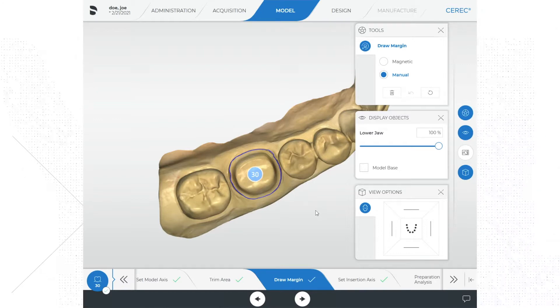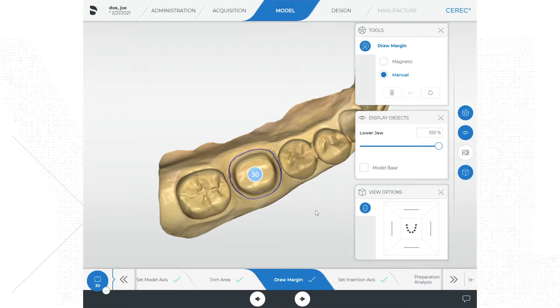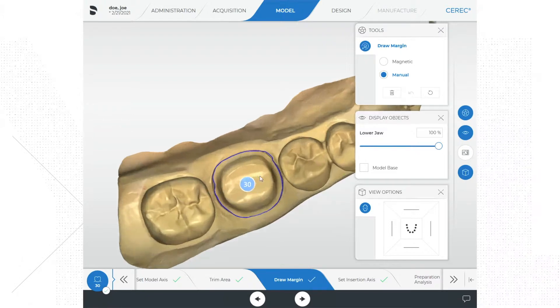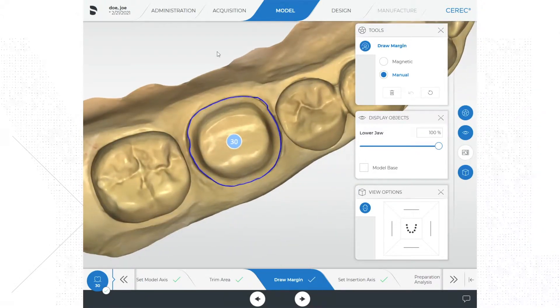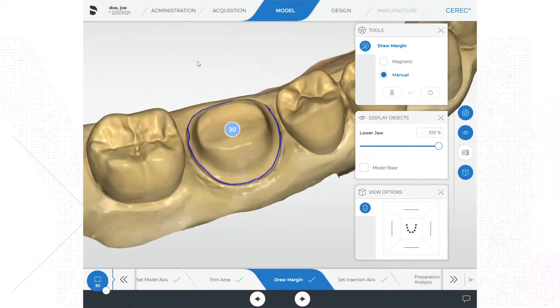That being said, I personally recommend that you go back and double check the margin tracing and make any necessary adjustments as needed. The software is not perfect and often makes mistakes on the margin. I also like to check the model axis as well, verifying its accuracy.